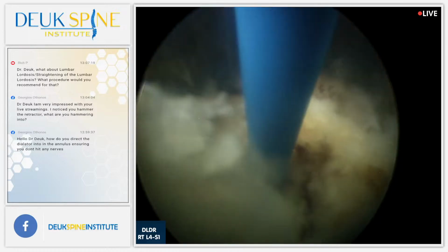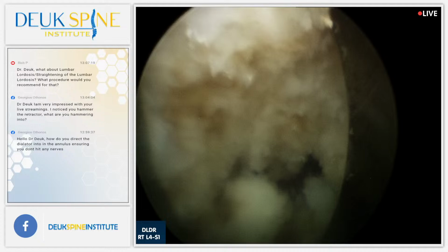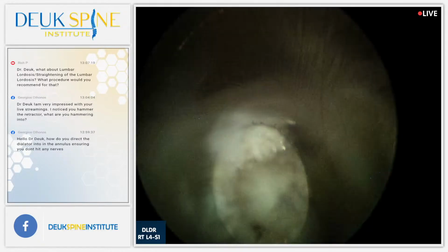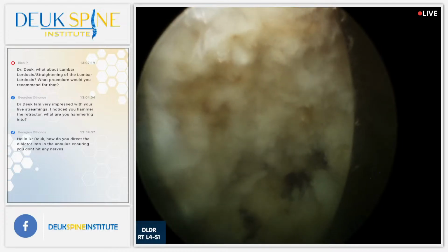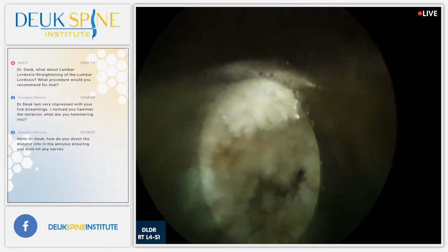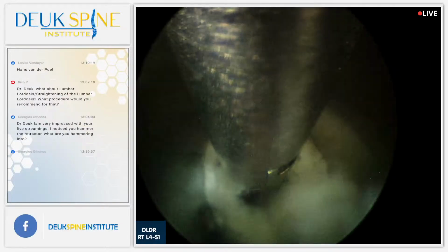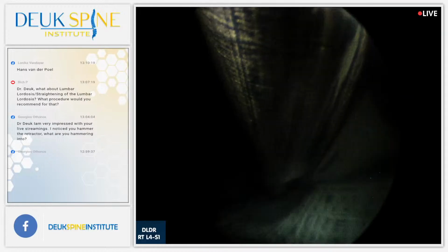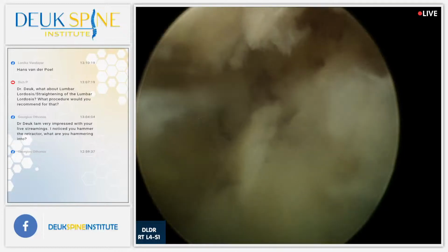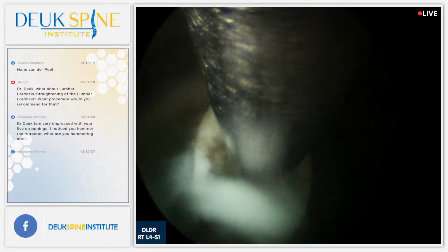But to get back to the flat back deformity, the first thing I do is a Smith-Peterson osteotomy on both sides. Remove the abnormally enlarged facets that are not going to want to move otherwise. And then you can actually reduce the curvature from being flat into being lordotic, which is what you're supposed to have. And you can do that by placing interbody cages. So the best way to do it is to go posterior through the back, do a laminectomy for decompression, because you need that done.